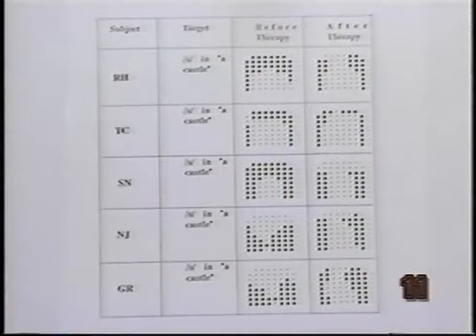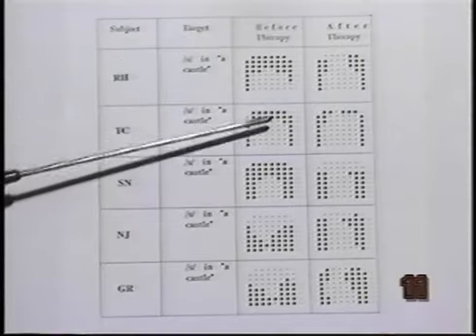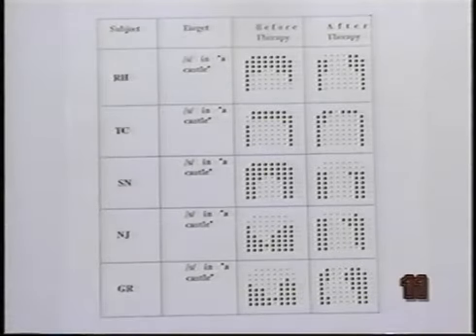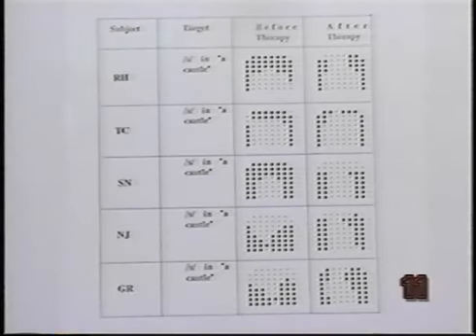These EPG patterns are from 5 children who took part in the project. The target sound is the S in a castle. One frame only has been selected, that of maximum constriction during S production. The 5 children had a variety of abnormal patterns for S before therapy. After therapy with EPG, the patterns more closely resembled a normal S configuration, and they were also heard as acceptable productions.